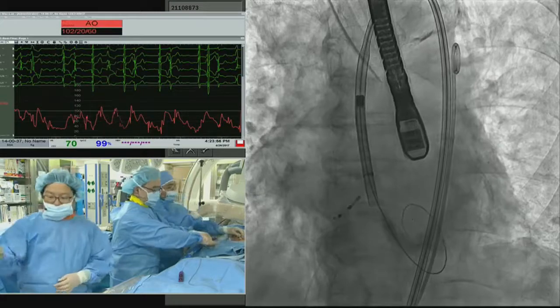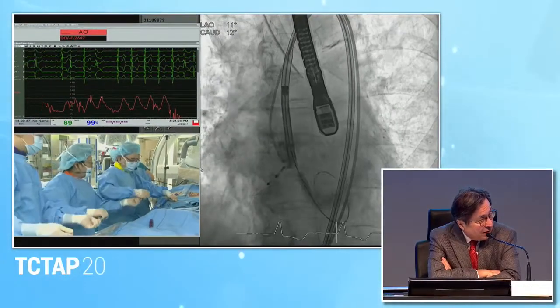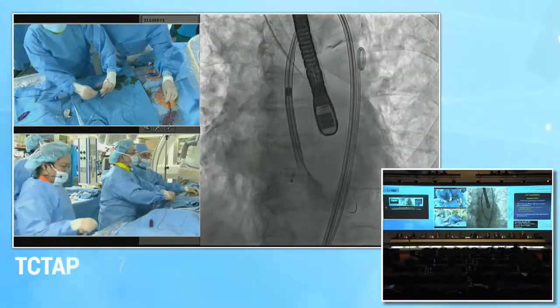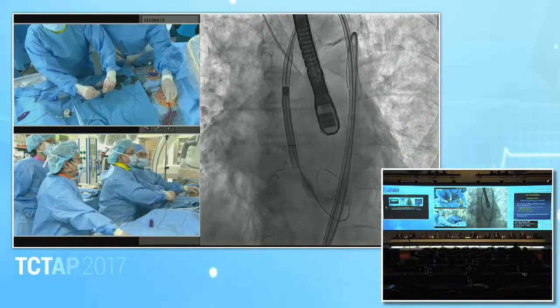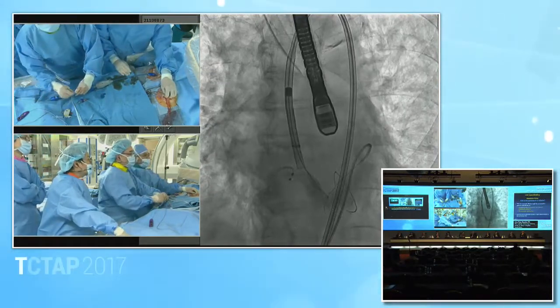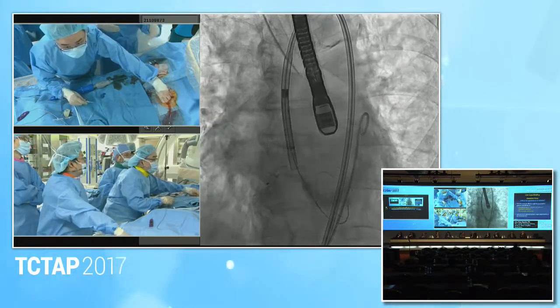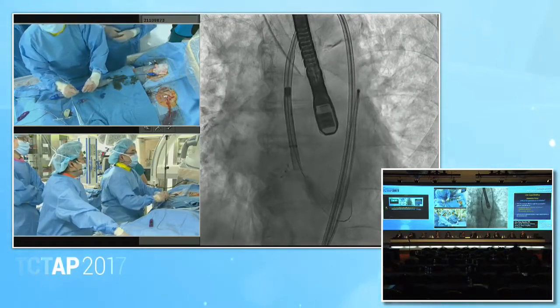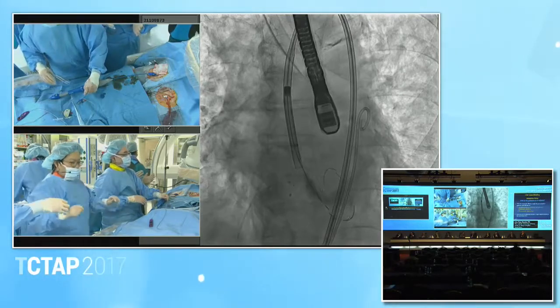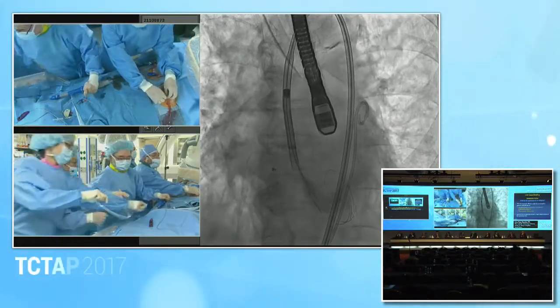Yeah, that's an important point that Dr. Walters brought up, the somewhat horizontal angulation in the LVOT direction. The patient has a little bit of a horizontal aorta, so first of all, the implant like this, and then the NCC side very high, and then the RCC side deep in the LV. After 80% deployment, I change the layover a little bit, so the valve maintains coaxiality after layover, and we can decide after that. So you're going to implant very shallow on that non-coronary cusp and then try and lay it over.